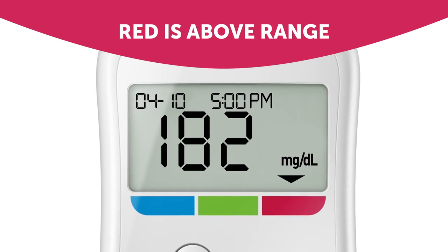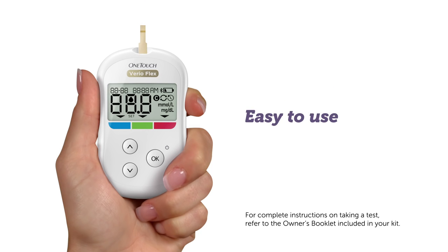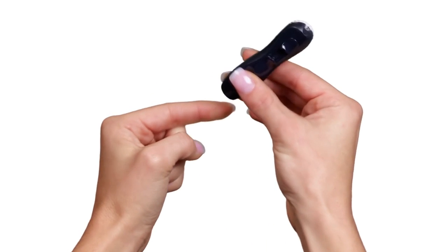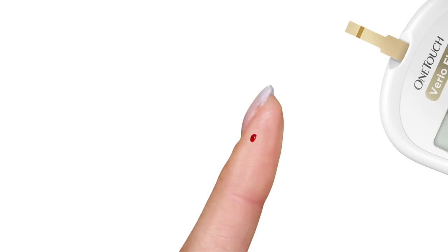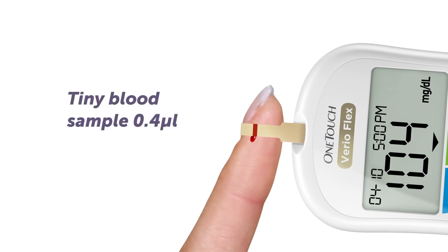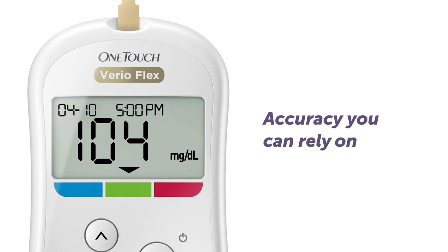Get results with this easy-to-use meter. Insert a new OneTouch Vario test strip to turn the meter on. Hold the OneTouch Delica lancing device against the side of your finger and press the release button. Then apply blood to either side of the test strip. Just a tiny sample is needed for accurate results in only 5 seconds.